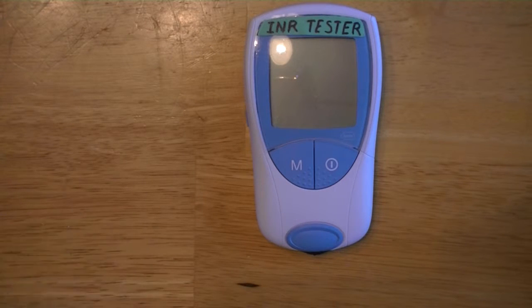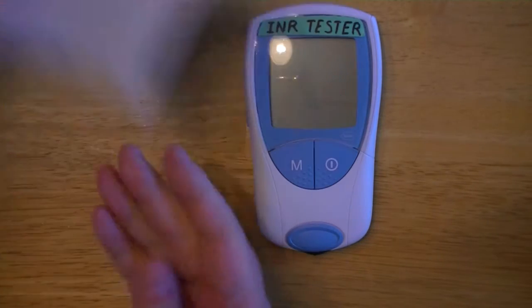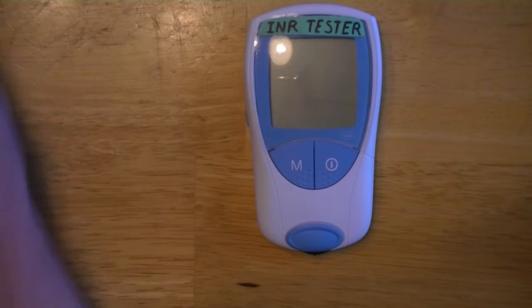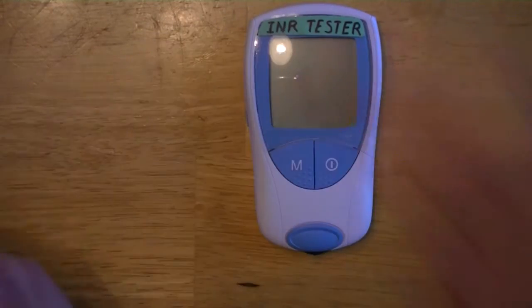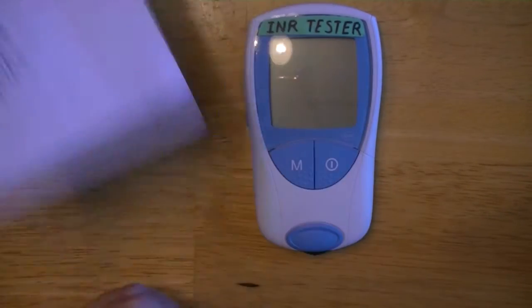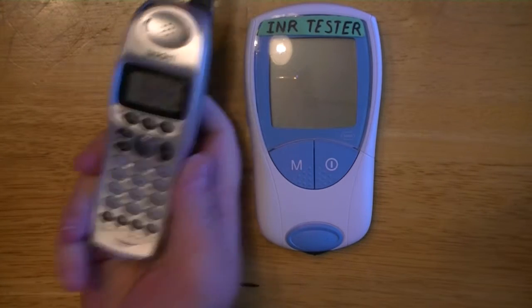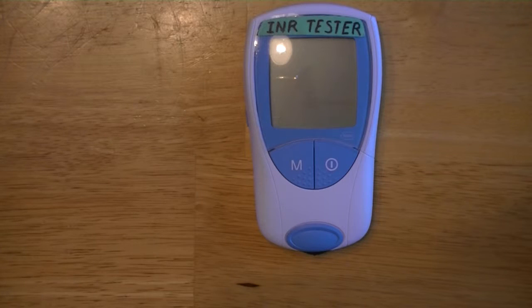When you're done, you're going to need to wipe the blood off your finger, then use a band-aid to cover your finger, and write your information down in your booklet. Then you're going to use your telephone to call it in to the place that monitors your INR.